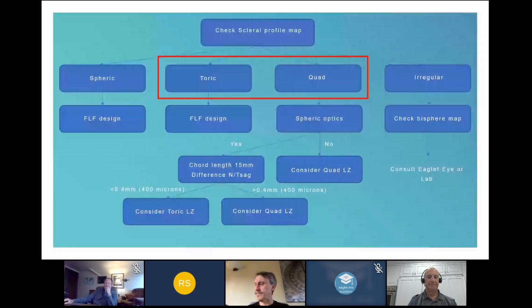So Ruby Kala is asking, is color coding similar to corneal topo? No, definitely not. It's just dividing into one of the four options, just giving you a quick feeling for what kind of scleral lens will be what I need. FLF means first lens fit. That's the name we gave to our automated algorithms. That was a question from Aaron Wolf. Tom Arnold already answered it.